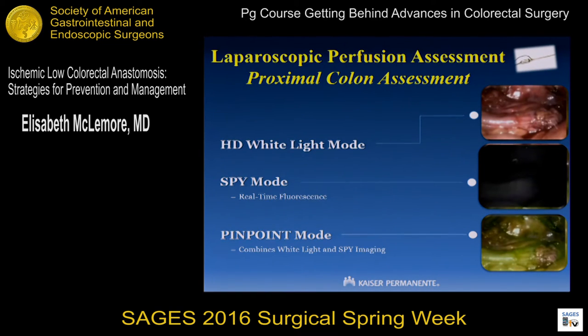So this technology is also available laparoscopically. And you can see the various modes, and it overlays those modes so that your eyes can see the brilliant green like in the first video. And my first aha moment when I started using the near-infrared imaging is that it's really a line in the sand. I used to think it was this scalloped border or maybe areas of great perfusion and poor perfusion, but it's literally, you can draw a line across the colon. You don't need to flail back on that anti-mesenteric side like we talked about during my training.